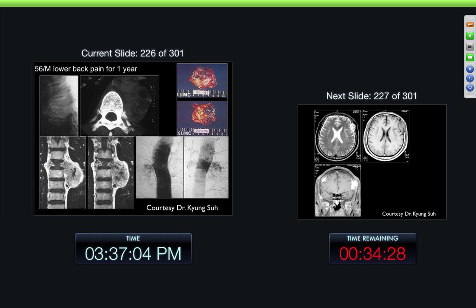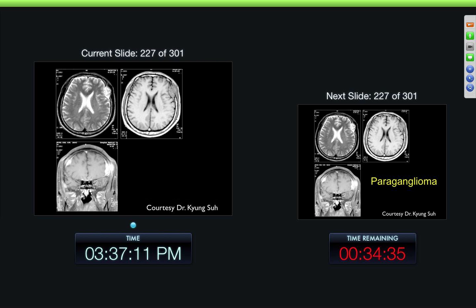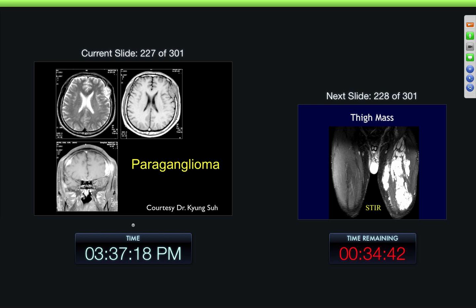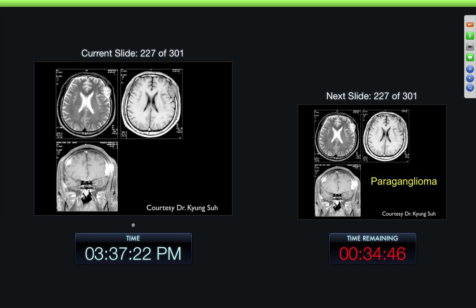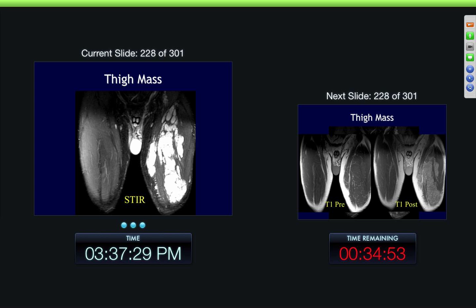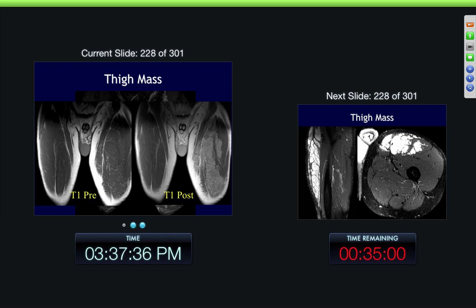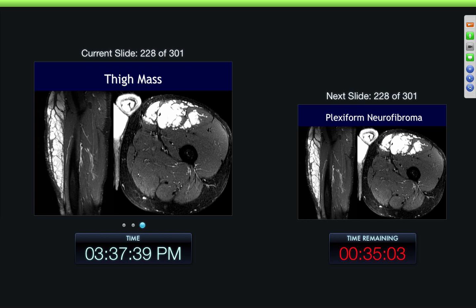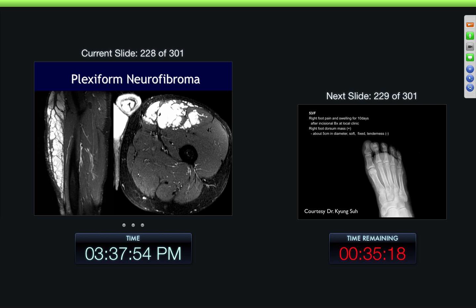56-year-old, lower back pain for one year. You can see a little marked inhomogeneity there with lesions in the skull. This was a paraganglioma. Thigh mass — notice how markedly inhomogeneous this is with very irregular margins, and also markedly inhomogeneous with what looks like fingers kind of extending out from it. Look at all the thickened septa in through here. Now we're in the neuro section — so this was a plexiform neurofibroma.